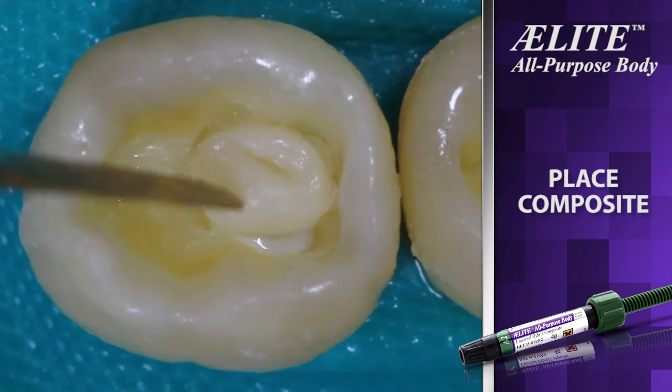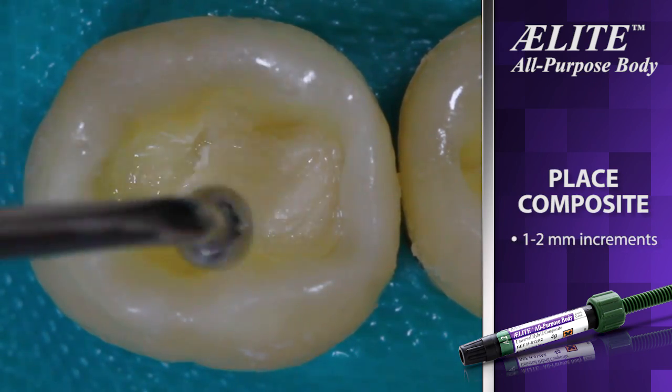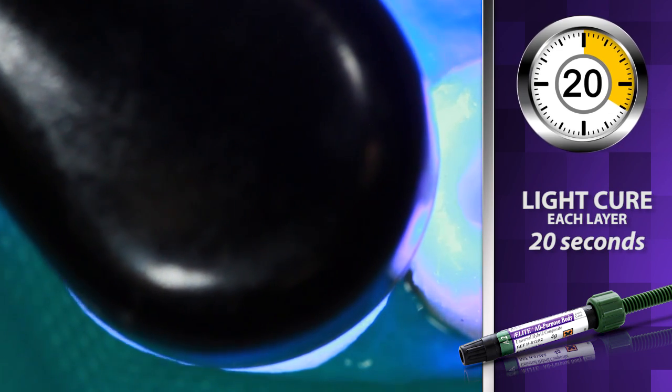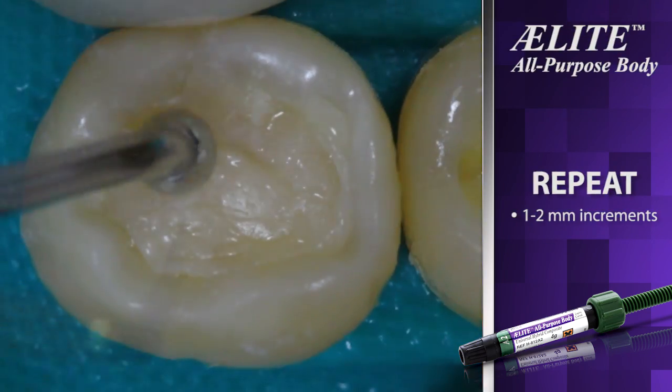Place Elite All Purpose Body Composite in 1 to 2 mm increments. Light cure each increment for 20 seconds, or if using an opaque shade, light cure for 30 seconds. Proceed with enamel composite placement.